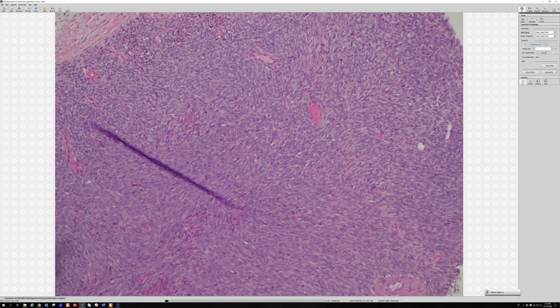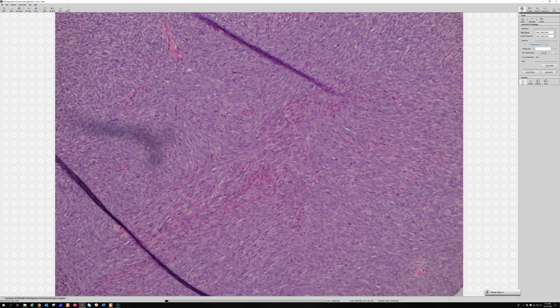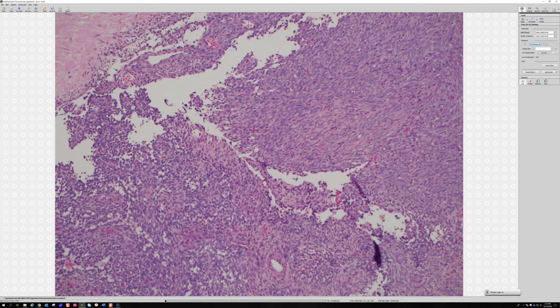And one final point that Dr. Weiss brought up to me is that S100 often stains synovial sarcomas. I think it tends to be patchy and not diffuse and strong. At least I cannot personally recall seeing a case that was strong and diffuse. But she did point out that it's a pitfall to watch out for: just because S100 is positive, that's definitely a known thing that can happen in some synovial sarcomas. So good to know that.